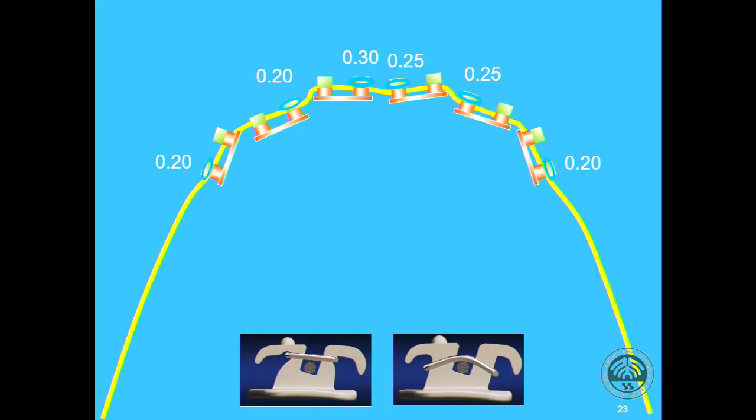So for mild rotation, we use a higher size ligature, so you can always get a suitable archwire deformation. With MLF, the orthodontist can adjust the first order clearance for each tooth on the same archwire. That's the best way to adjust the friction, giving the orthodontist more control over friction.